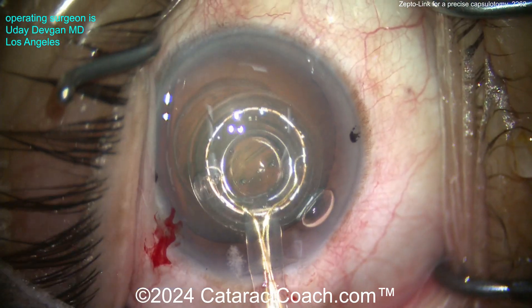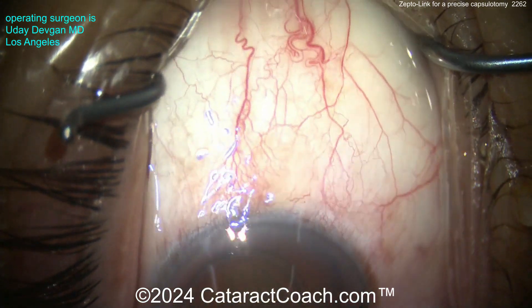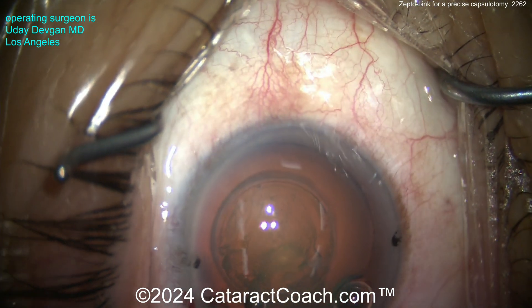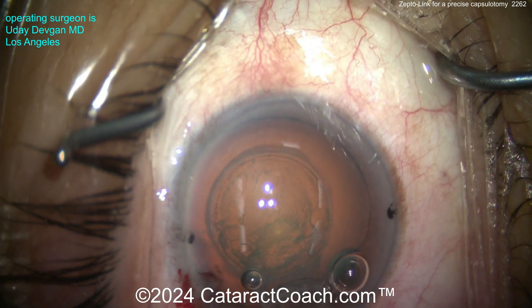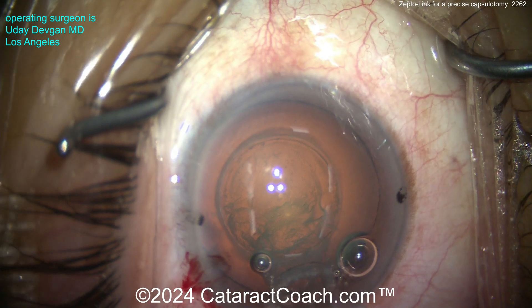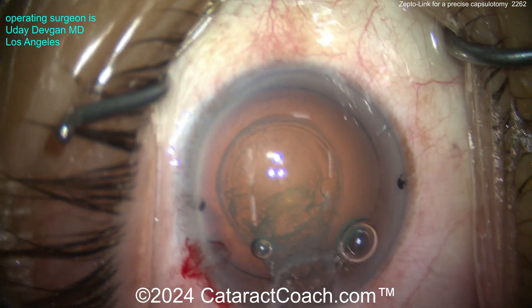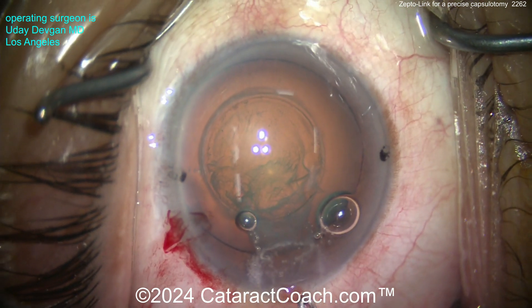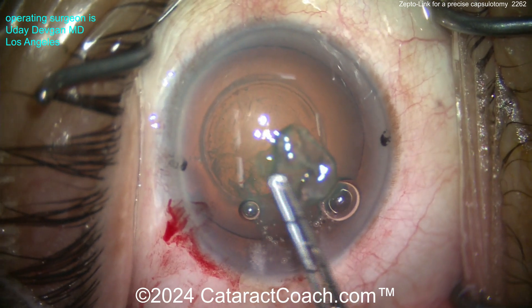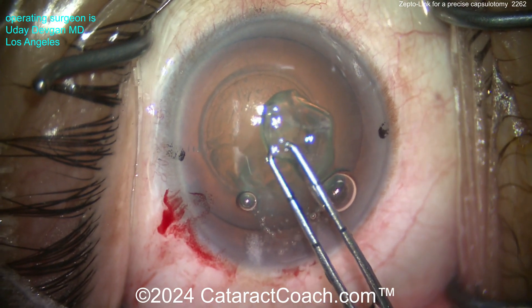Boom — 0.004 seconds. So four milliseconds of energy delivered, and there you go — beautiful capsulotomy and you're done. Pull the device out of the eye and continue with your case. Now you have a very precise, very exact 5.2 millimeter capsular opening, and on top of that it's very strong.